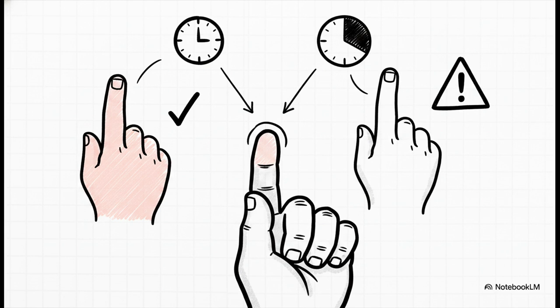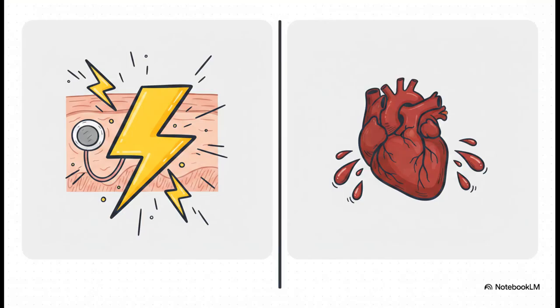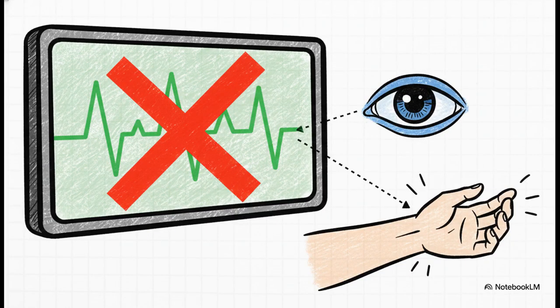If you press on a finger for 3 seconds, a capillary refill of under 1.5 seconds is considered completely normal. But if that refill takes greater than 5 seconds, that is highly indicative of shock. But wait, here is a massive pitfall. You'll be staring at the electrocardiograph, the ECG, which measures the electrical activity of the heart at the skin surface. Now, the ECG might display perfectly regular electrical activity, but it does nothing to guarantee there is any actual cardiac output. And that severely limits the ECG's usefulness as a standalone monitor.